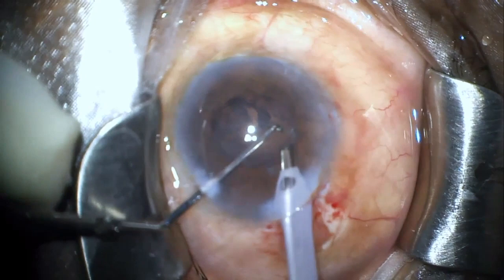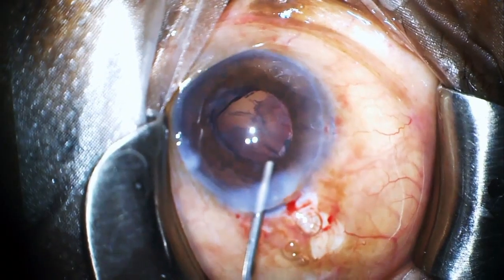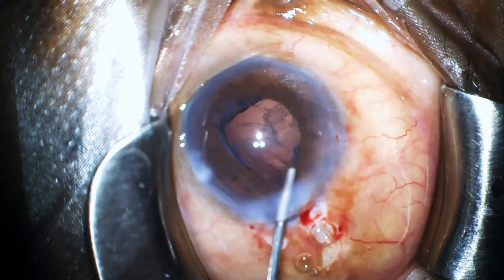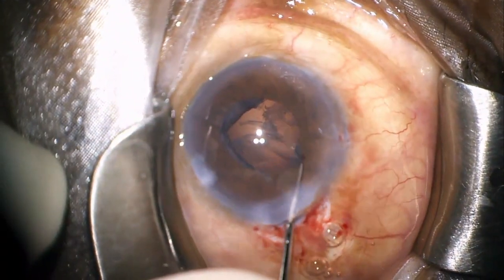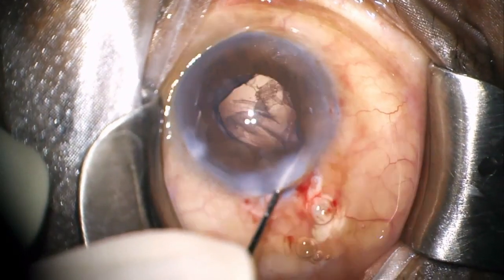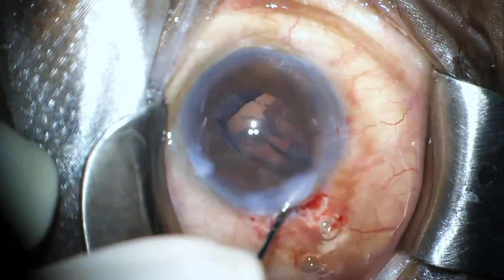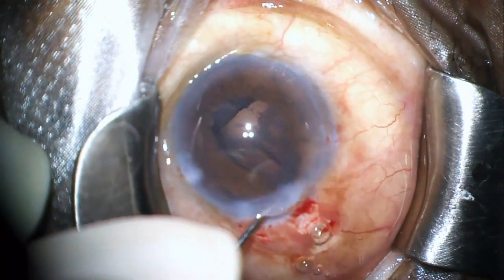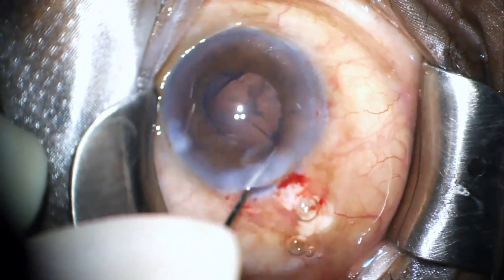But then I thought it's not a good idea to use a sharp chopper for this purpose. So I filled the chamber with viscoelastic and then used a blunt Sinskey hook and attempted to mobilize the piece and bring it towards the center. I was actually not sure if the fragment was under the iris or in the capsular bag. However, using the hook didn't help.